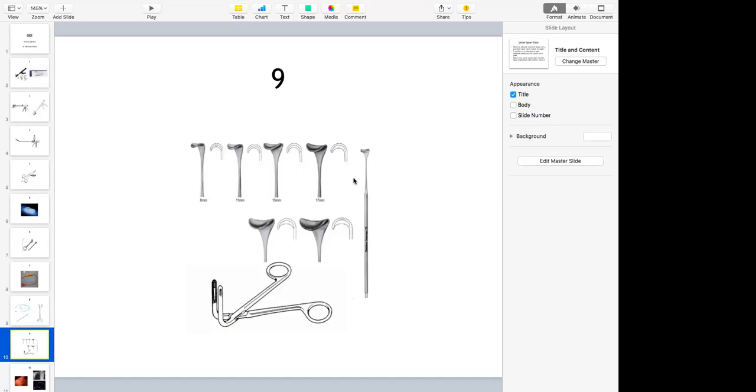Now you tell me what is the use of the Gilvernet retractor specifically. It is a delicate retractor which is placed at the junction of the renal parenchyma and the pelvis to expose the pelvis before you incise the pelvis to extract stones.